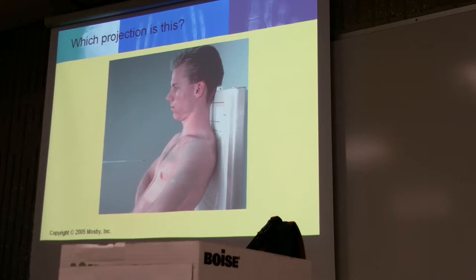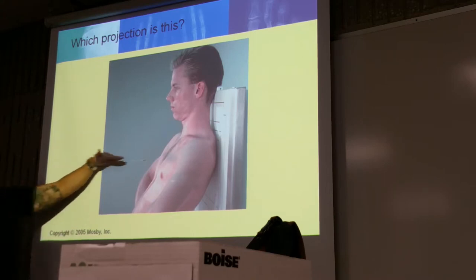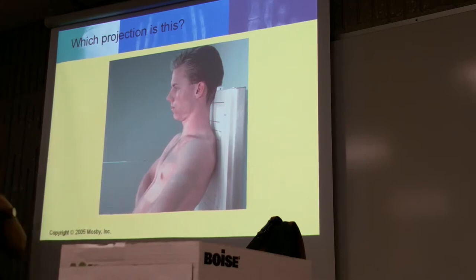Now, the axial, remember the axial is a change of angle of 10 or greater compared to the long axis of the human anatomy, right? This also applies to leaving the central ray alone, but now my central ray is not axial, it's my patient who is axial. So this is known as AP axial projection of the chest, but this particular position here is known as the lordotic position.